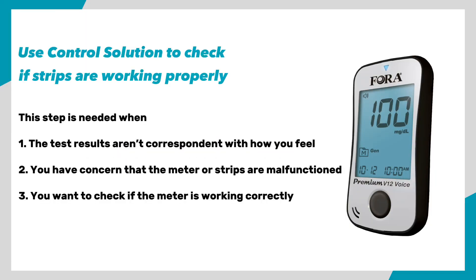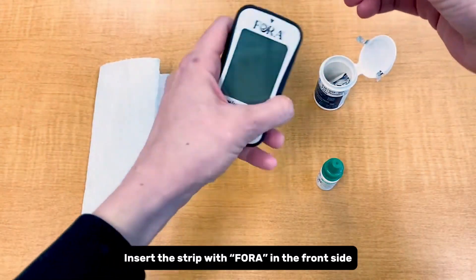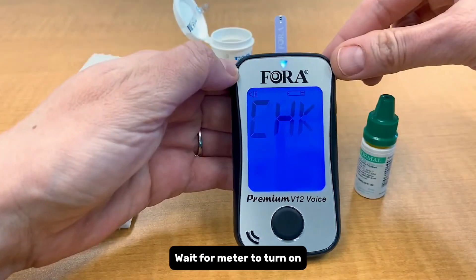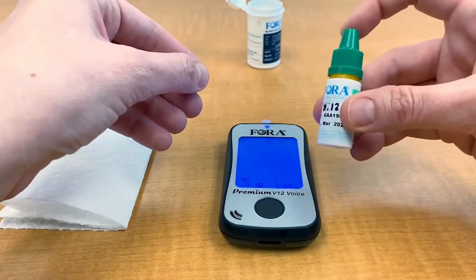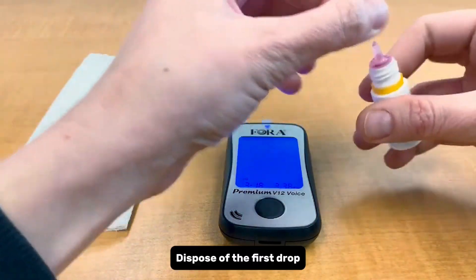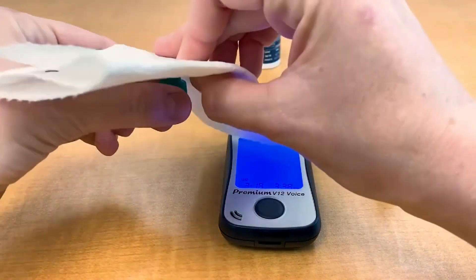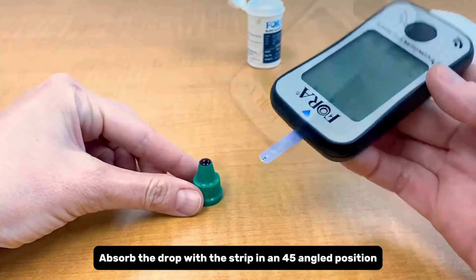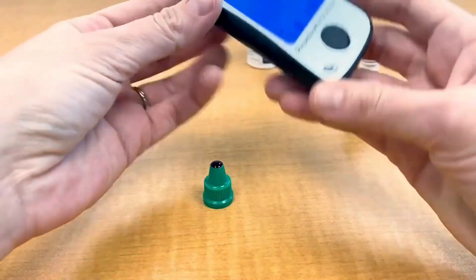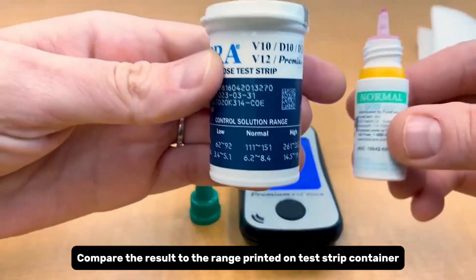Control solution test. Use control solution to check if strips are working properly. Take out a glucose test strip and insert it with the four in the front side. Wait for the meter to turn on. Press the main button until QC appears on screen. Shake the control solution bottle and dispose of the first drop. Squeeze a drop of control solution onto the cap of the bottle. Absorb the drop with the strip at a 45-degree angle. Wait five seconds for the result, then compare the result to the range printed on the test strip container.